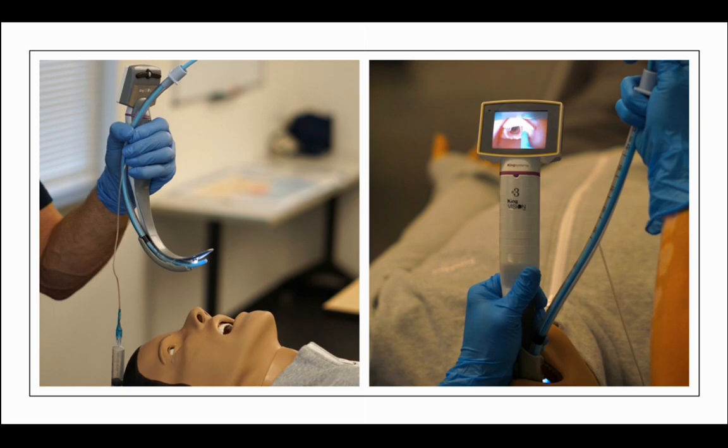This allows you to walk down the airway, place the tip of the King Vision in the vallecula, slightly rock back, and then that coude tip will be angled right through the vocal cords as you see here. This is a really great way to utilize a video scope and a bougie.